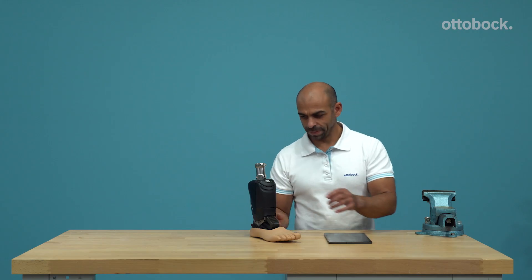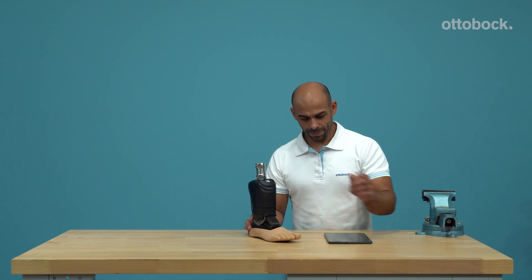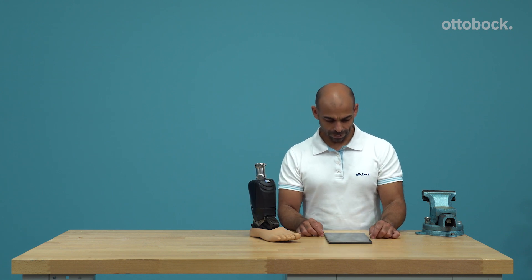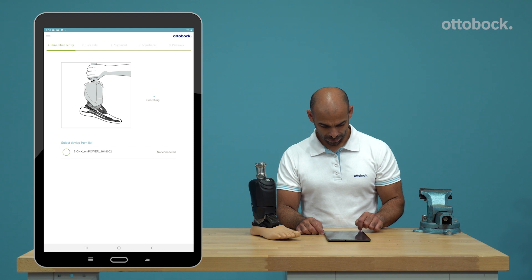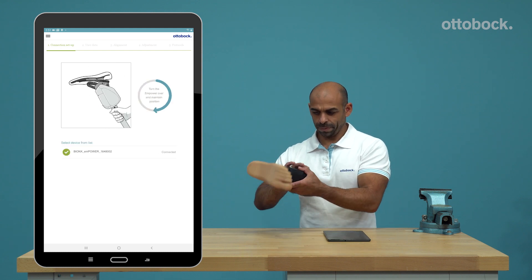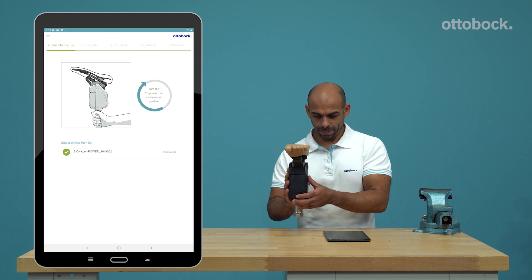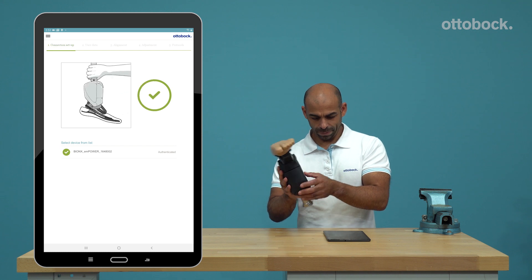Switch on the Empower before you start with the alignment. Push and hold the power button on the battery for at least two to three seconds. The calibration is confirmed by a singular beep and one vibration. To connect to the Empower with the app for the first time, please turn it upside down for three seconds. Now you can select the chosen Empower in the app.